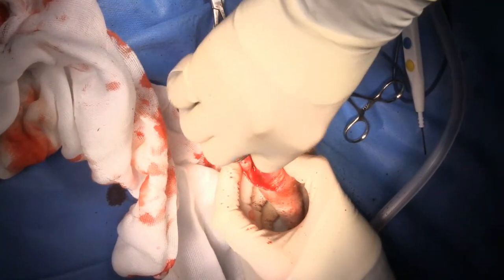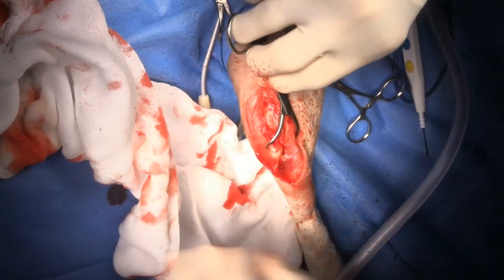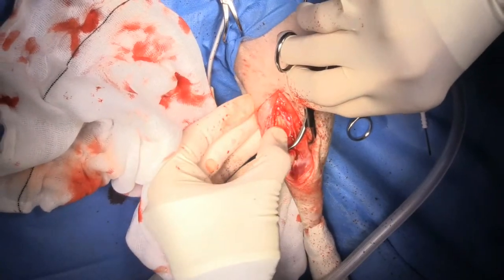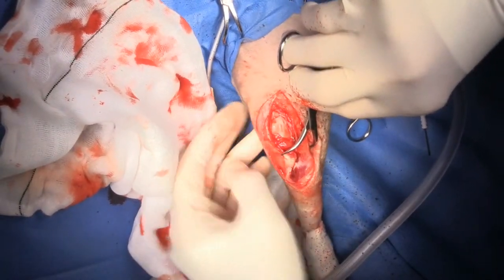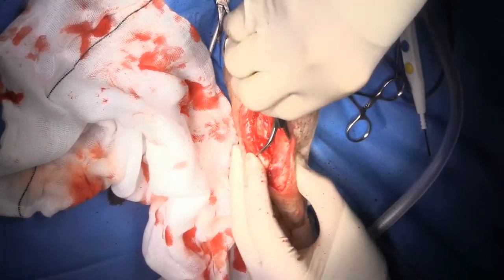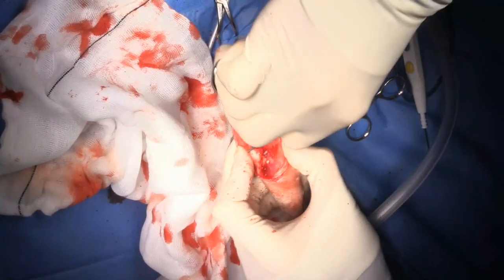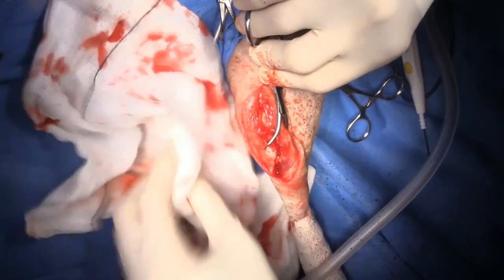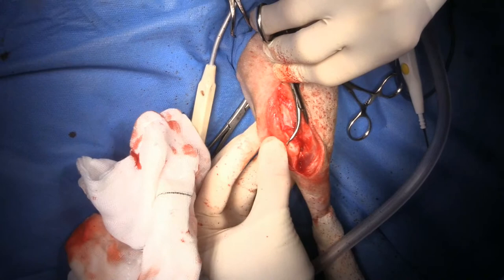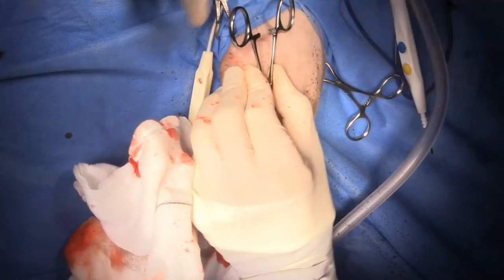I'm going to use my towel clamp just to hold the crest in place and then see if the patella wants to stay in. I can still barely pop it out but it really wants to stay in. I can feel the bed over here so I've really moved it over - go ahead and grab onto that tightly for me.